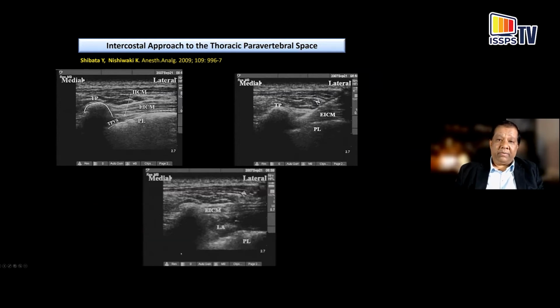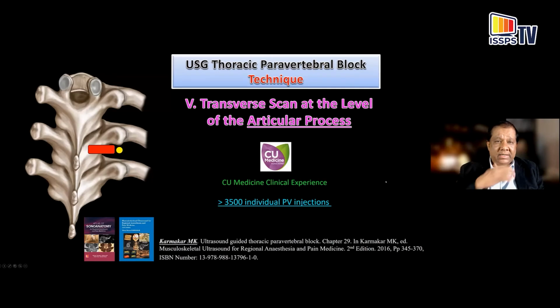But actually, the paravertebral space is on the dark side of the moon, or in this acoustic shadow, if you may. We have been using a slight variant of this technique for over 10 to 15 years now. We perform many thousands of individual paravertebral injections, and I believe this is our go-to when we perform these paravertebral injections using a transverse scan. It's an in-plane technique at the level of the articular processes.